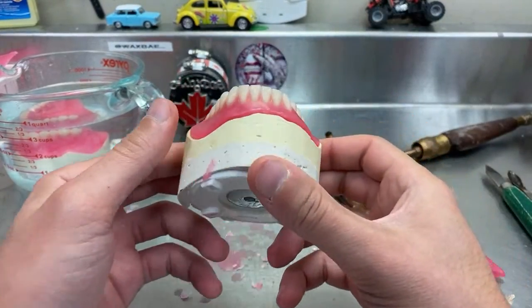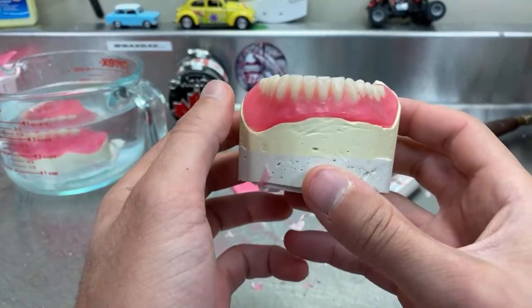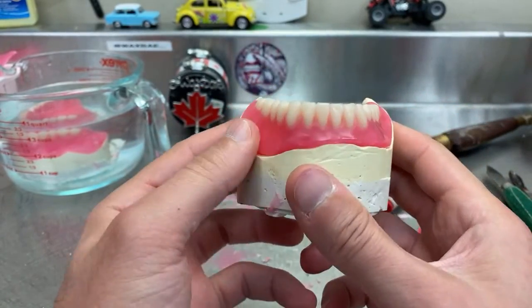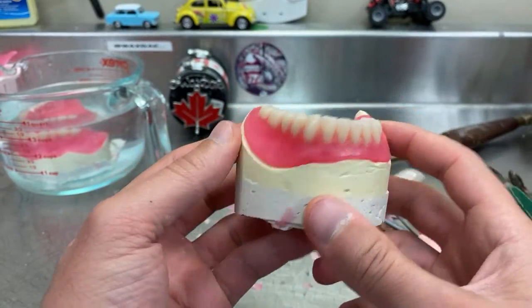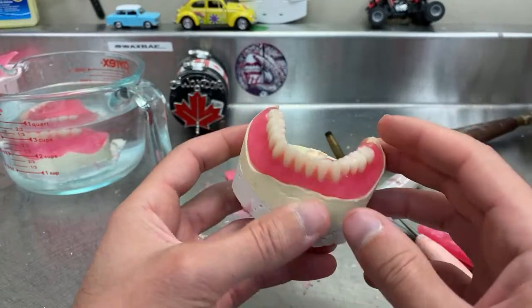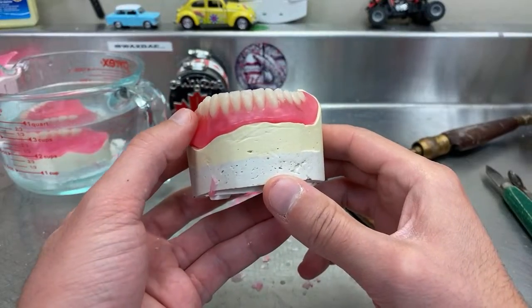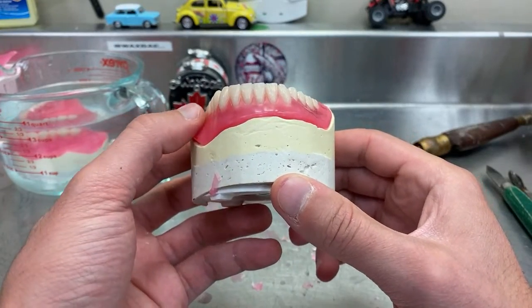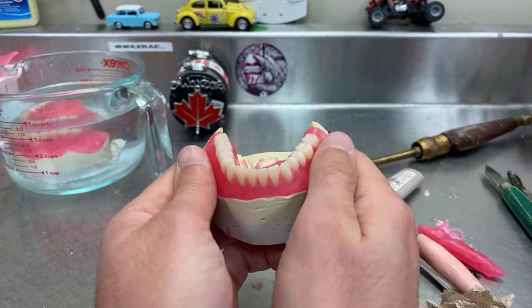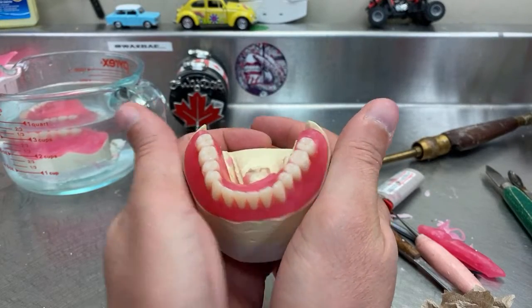One thing you notice when I do the wax up, especially on lowers, is to create that roll here. And this is very important for stability and retention. On the lowers, usually retention is bad because people don't have enough bone structure. And by creating this little roll or a divot or whatever you want to call it in the flange, it actually creates some sort of a resting shelf for the muscles.